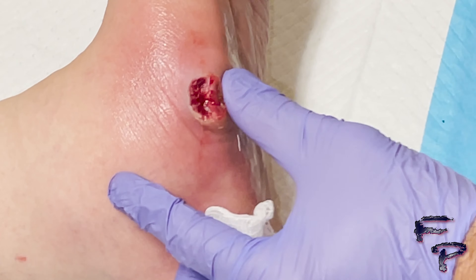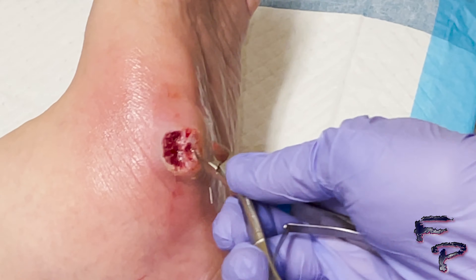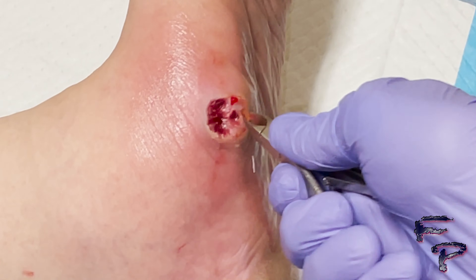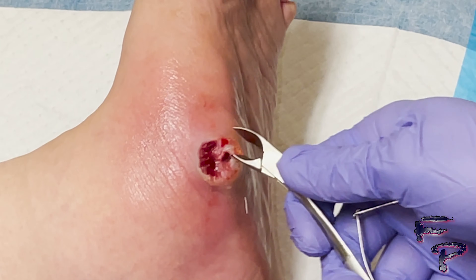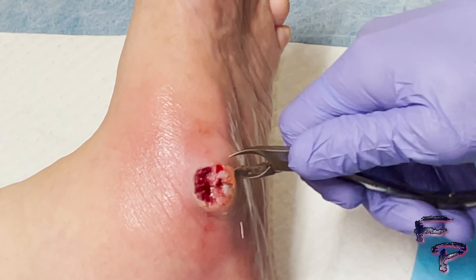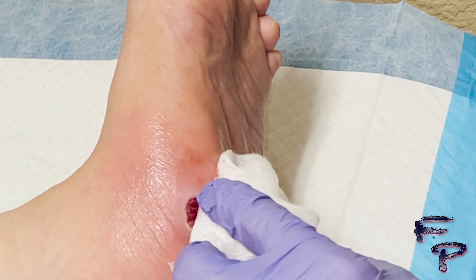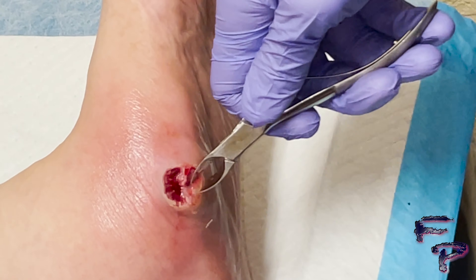I compress — there is still another space. I work my way around, using the central tunnel as a starting point and debriding all non-viable tissue circumferentially around that starting point, trying to avoid cutting healthy appearing tissue.